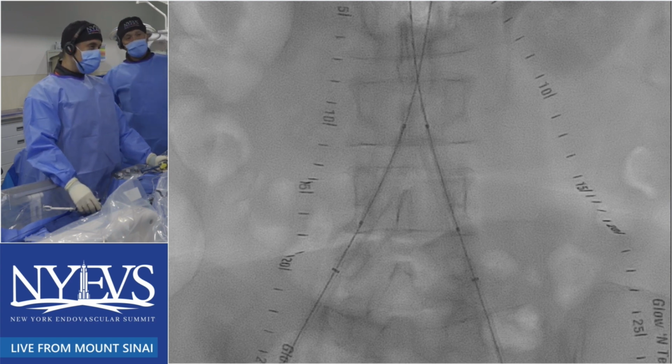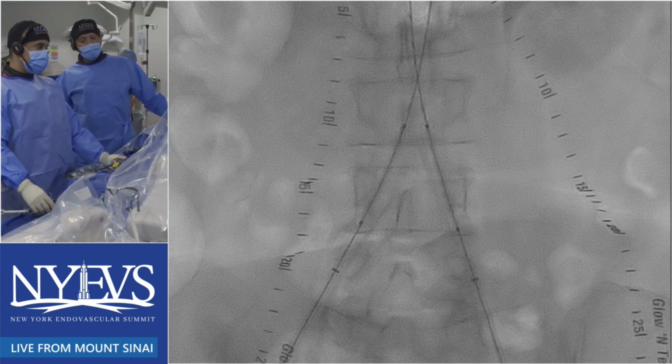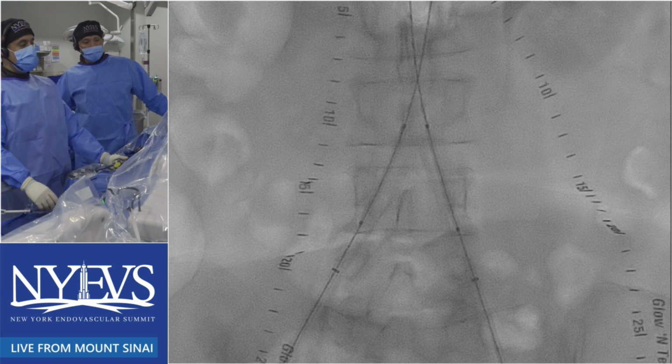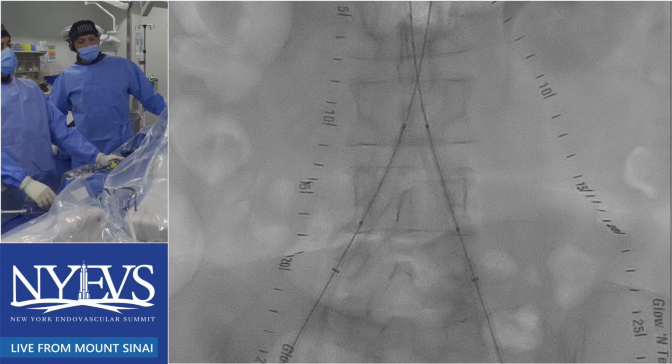No, I just wanted to ask the panel a question. We used an 8.0 IVL. The vessel reference is around 8.4. So if you're using a bare metal stent and it's underexpanded, which most likely it's going to be, how aggressive are we going to balloon? We can't use a 9.0 in an 8.4 vessel with a bare metal stent.